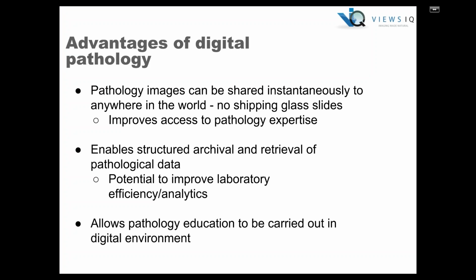Implementing digital pathology has a number of advantages for both clinical and educational institutions. For hospitals, digital pathology can help remove barriers of access to pathology expertise. Through telepathology, institutions that lack expertise in a particular subspecialty can consult external experts for difficult cases. This leads to greater collaboration amongst healthcare providers, and ultimately it improves the standard of care for patients.